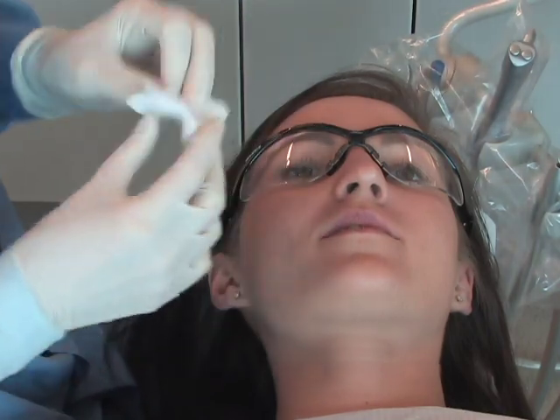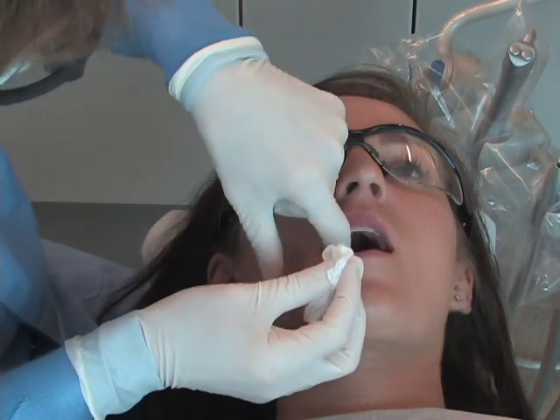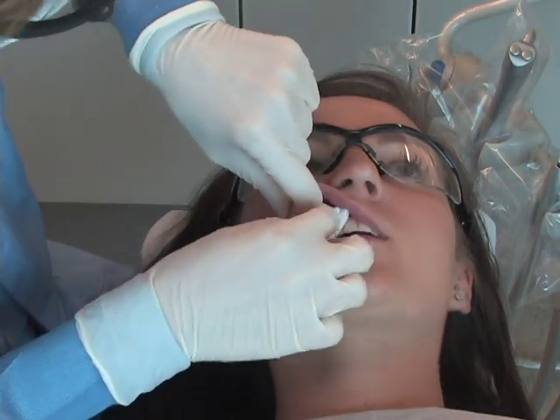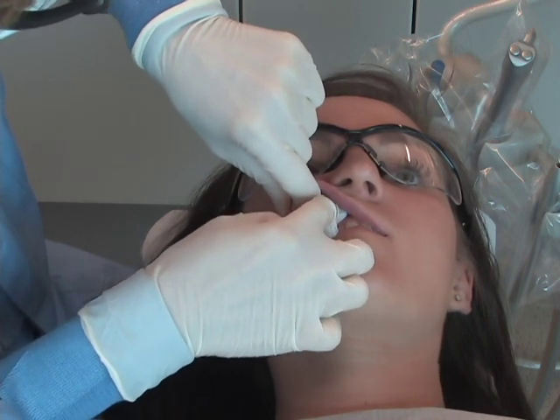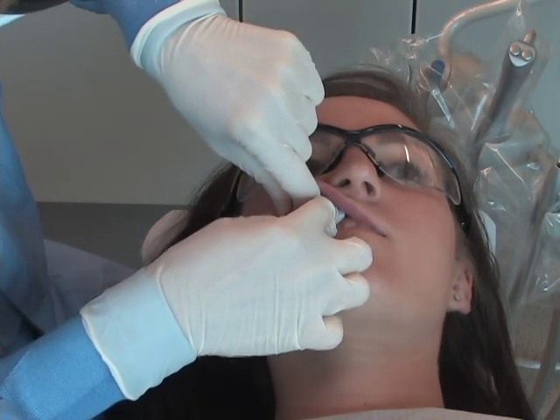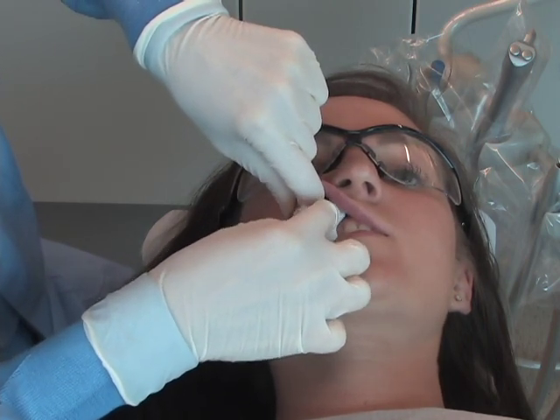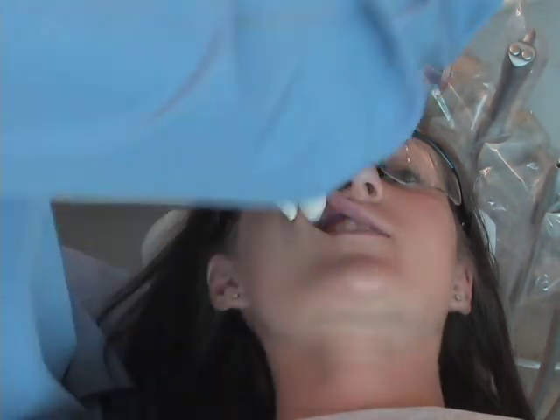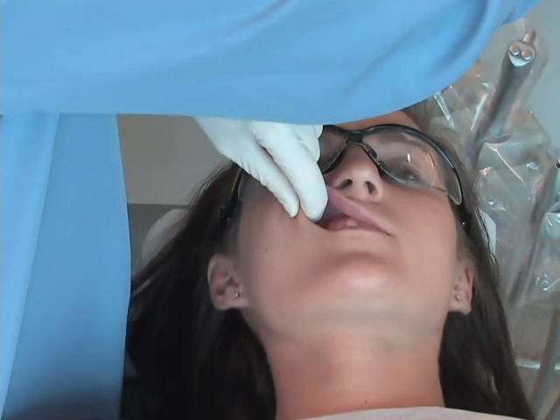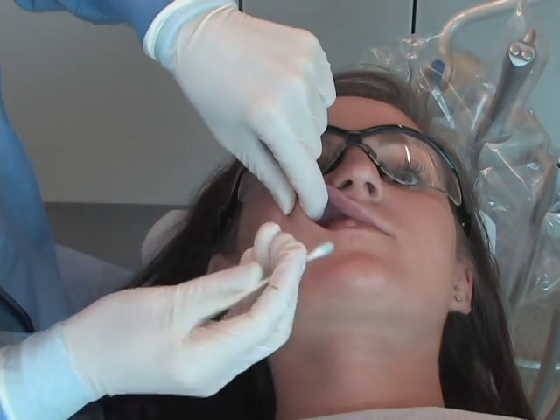Dry the injection site with a sterile gauze square and apply topical anesthetic for no less than one minute. By drying the injection site, the effectiveness of topical anesthetic is increased, and the improved visibility makes it easier to orient the bevel of the needle.